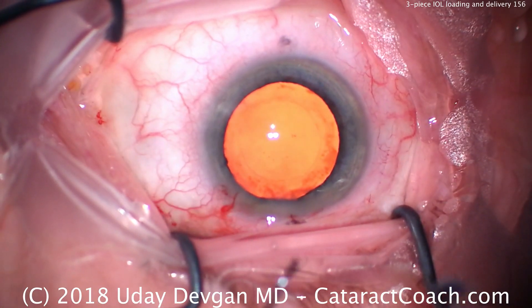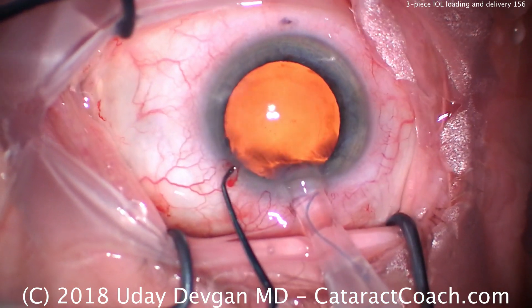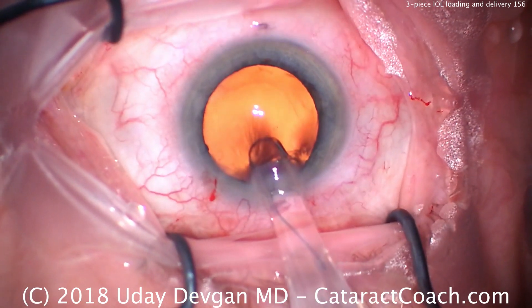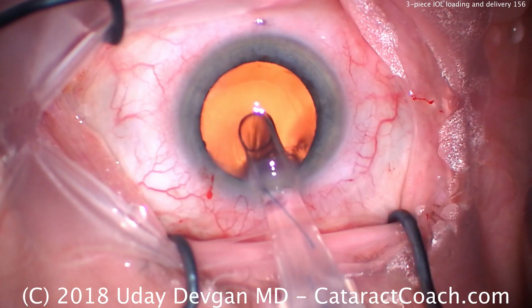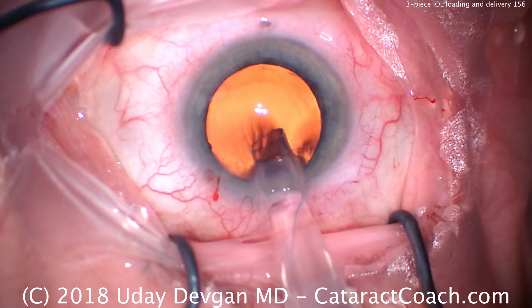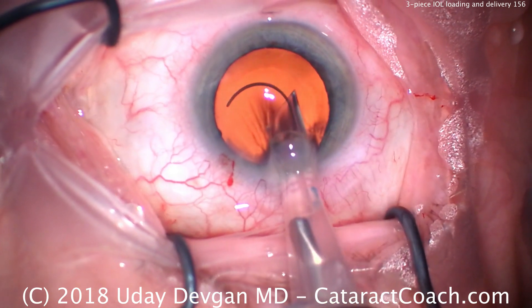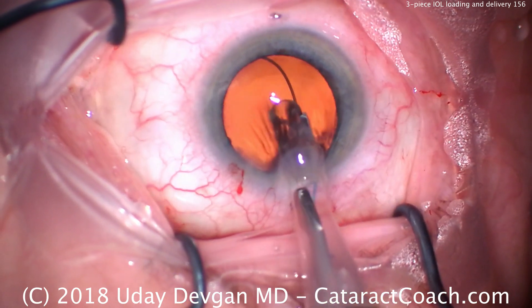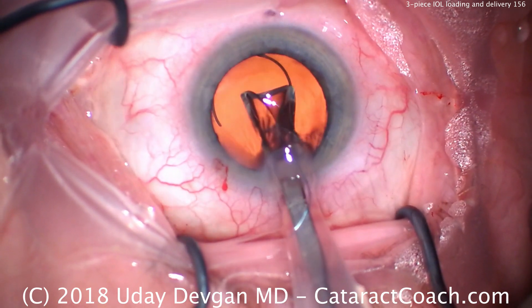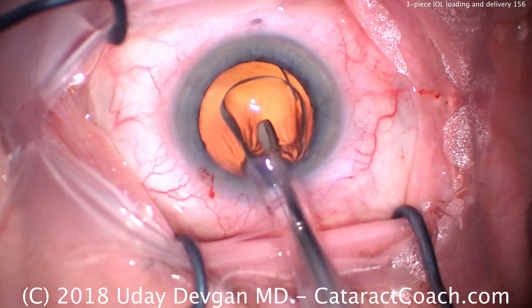When we put it inside the eye we start off this way, but we have to now twist the injector upside down — flip it over. Flip the entire injector over. Now deliver so that the leading haptic still comes out in the correct orientation. Now stop. Flip the injector back the other direction, and now deliver the rest of the IOL.